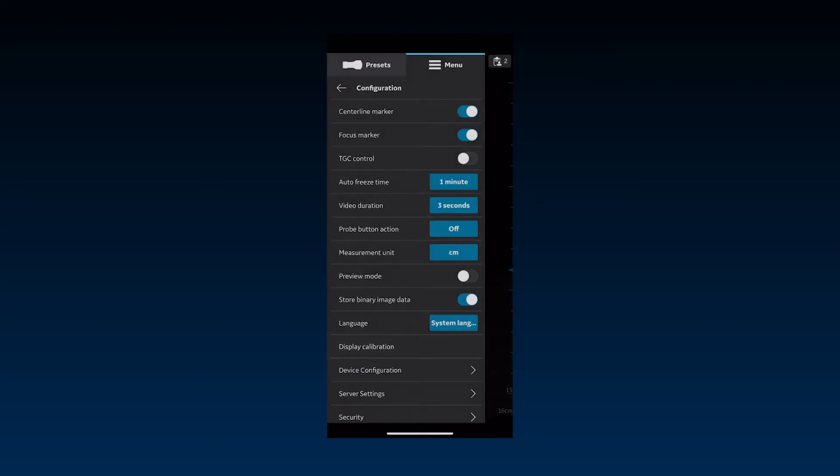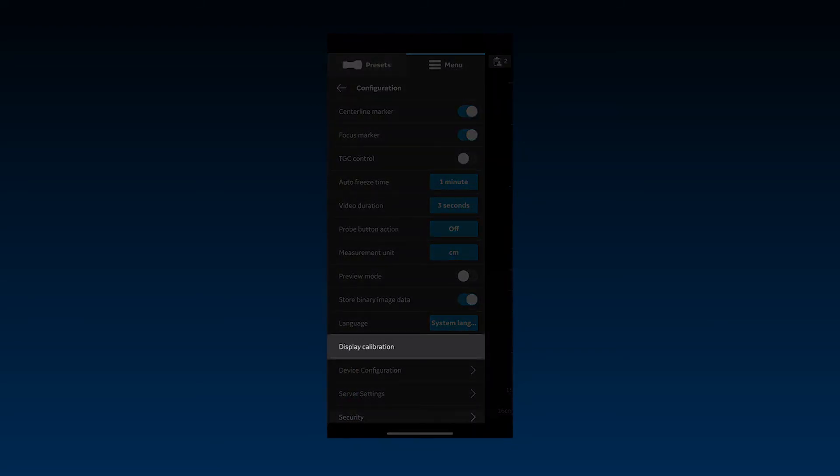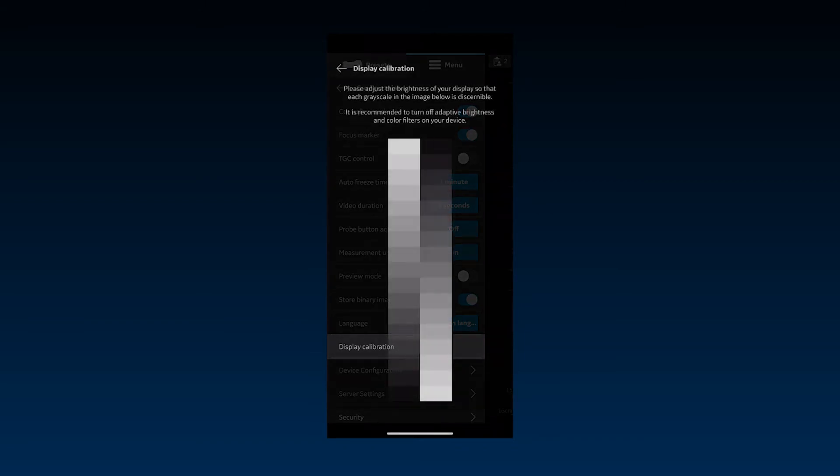For optimal image visualization, it's important to adjust the brightness of your device for displaying the complete range for grayscale. The image under Display Calibration can be used to adjust the brightness of your device so that the darkest shade disappears into the black background and the brightest should appear bright, but not saturated.